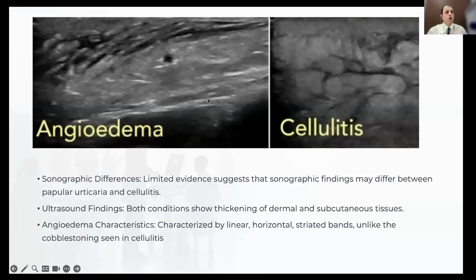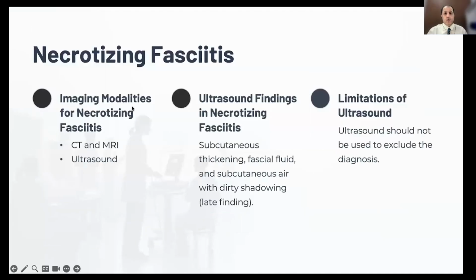But as a rule, we always need to coordinate what we find in the ultrasound with our clinical findings. For example, if the patient has a fever, then infection is the most likely cause. So always interpret what we find in our ultrasound together with our clinical findings.